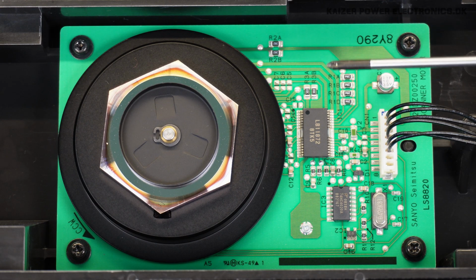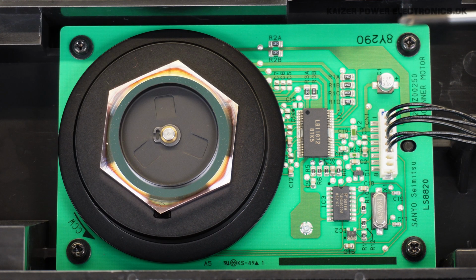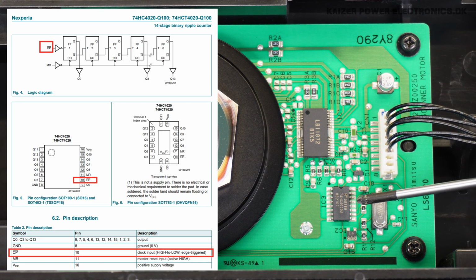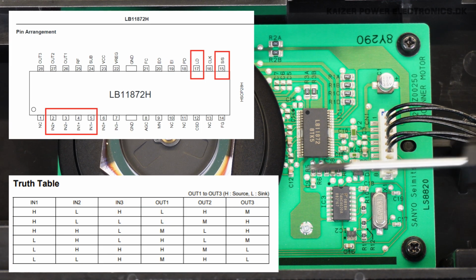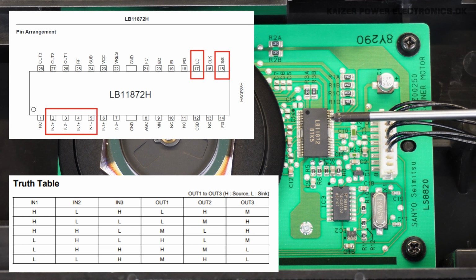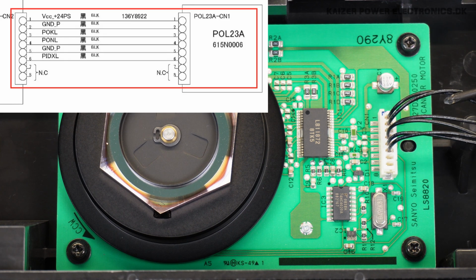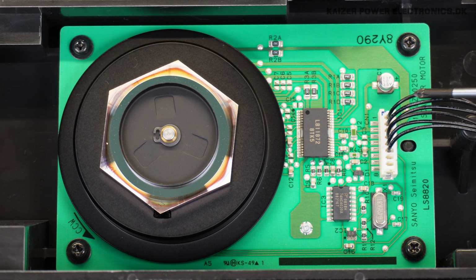It sits over here. The Sanyo laser scanner motor assembly here uses an LB11872 driver IC, but it does not use the clock impulse pin. If we check out the datasheet, we only have these six wires here. It uses a 74HC4020, which is a 14-stage sequential IC. So it seems that it is generating the pattern for driving a three-phase brushless motor with the 74HC4020 and using that to drive the IN1 and IN2 inputs of the driver chip itself. Now the wires here, according to the manual, are plus 24 volt DC, then some saturation detection, then a start/stop for the motor, then another ground, and last what is called PIDXL. That's the starting point for trying to get this to run.